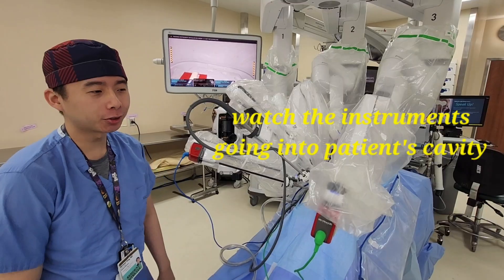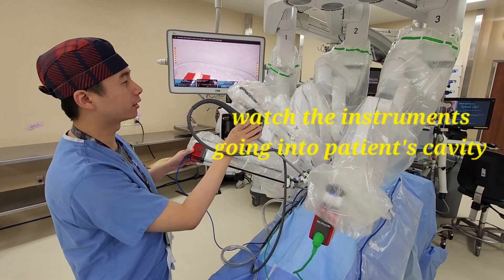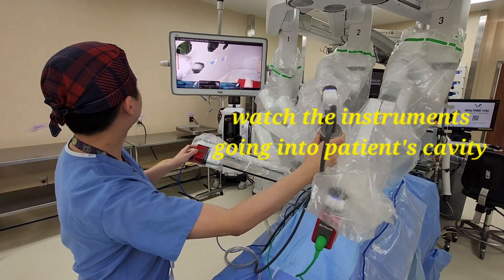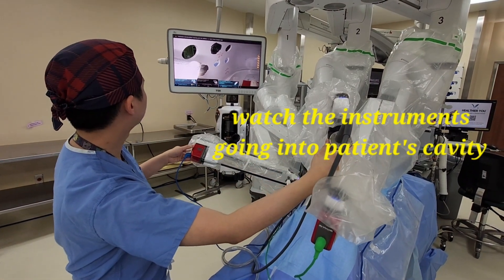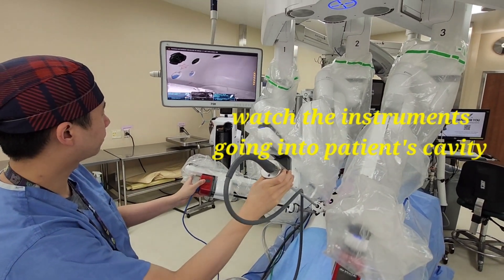Once you have the camera and instruments docked, you have to walk yourself with the instruments into the patient. Make sure to follow through and go in.